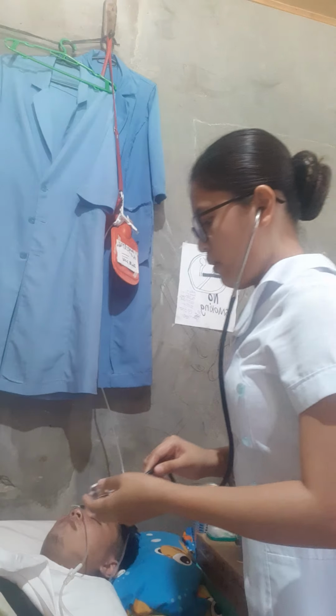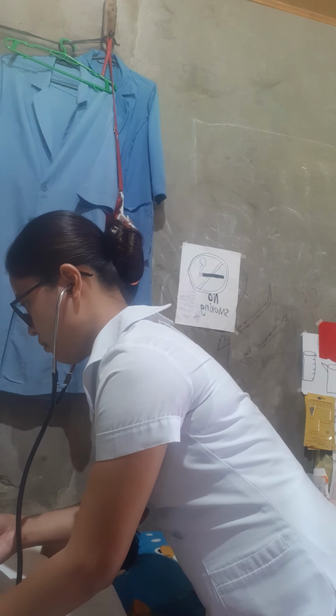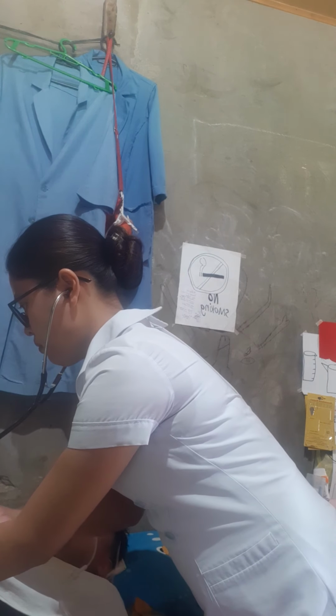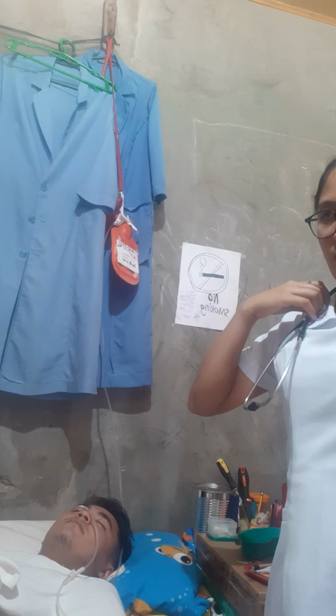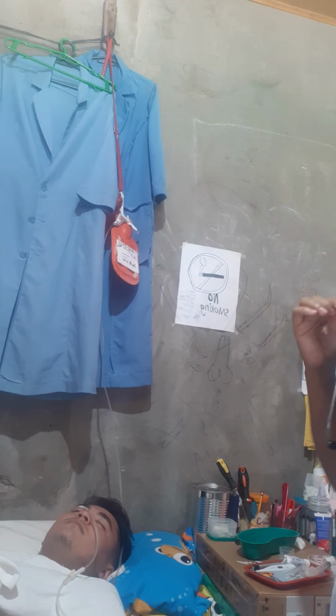Then for the bowel sounds, check that the sounds are good. Then regurgitation and feeling of fullness after feeding.